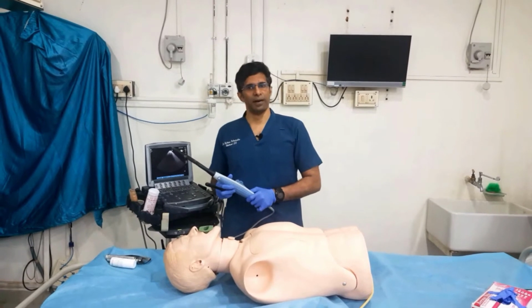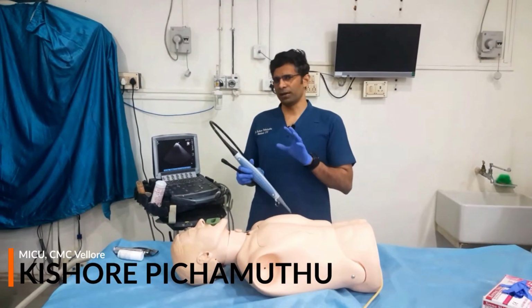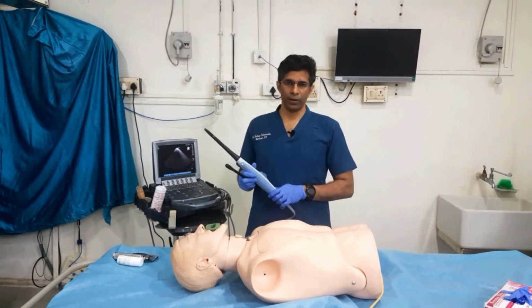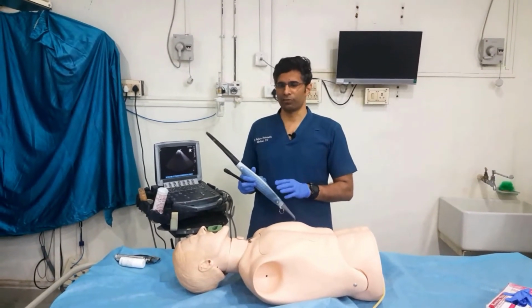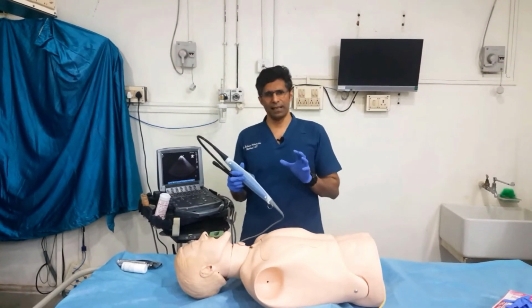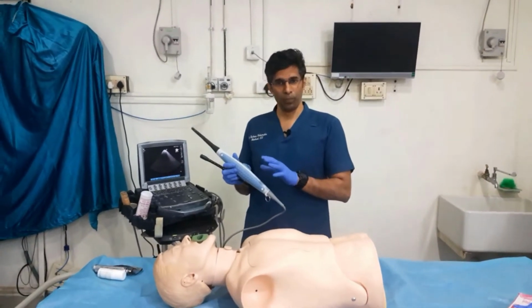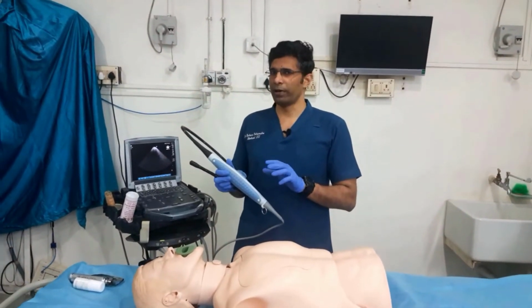Hello everyone, I am Kishore Pichamuthu from CMC Vellore, and in this short 10-minute session we are going to look at a few basic views of transesophageal echo. The objective of this session is just to familiarize you with the transesophageal echo probe and also to go through very few of the views.